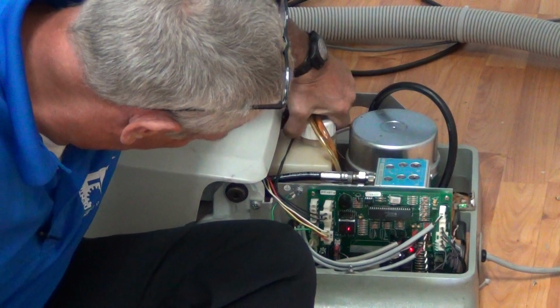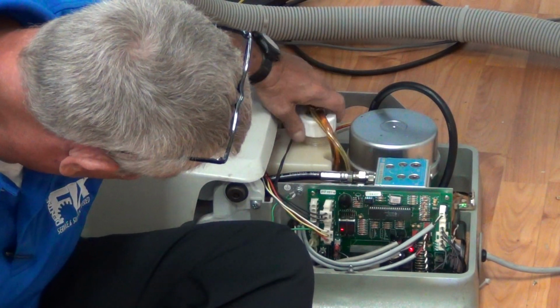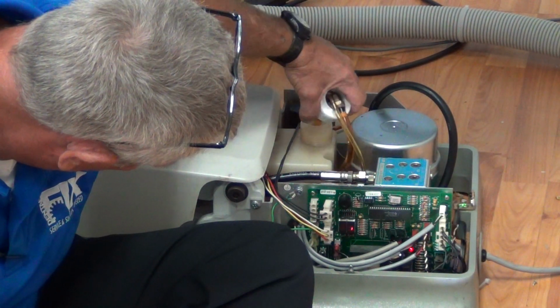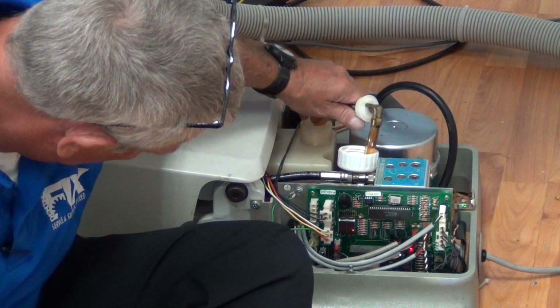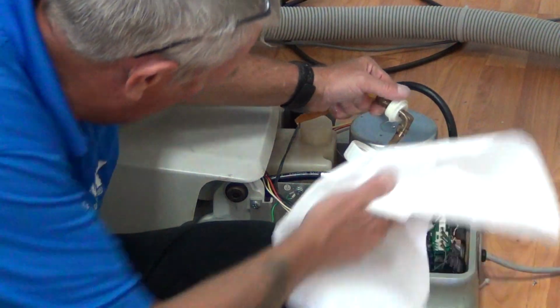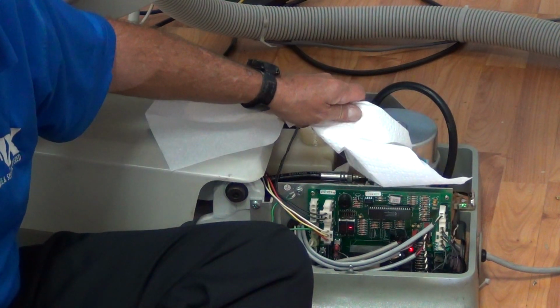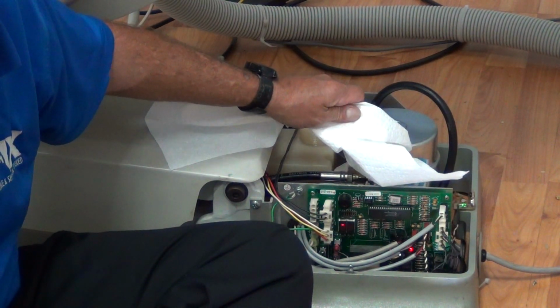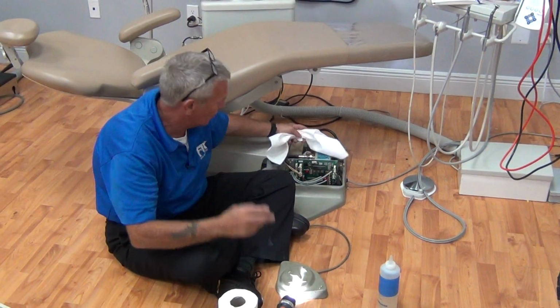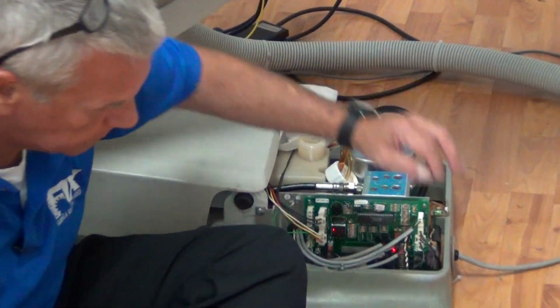We're going to unscrew our reservoir lid. Very carefully. Now, you see how I'm taking the fill spout out? Very carefully. When it flops out, it will sling oil all over the wall. You'll never get the oil off the wall. It'll ruin the paint. So do it like I did. Grasp it with a paper towel and don't let it go and fling oil out. Set it aside with a paper towel on it, okay?